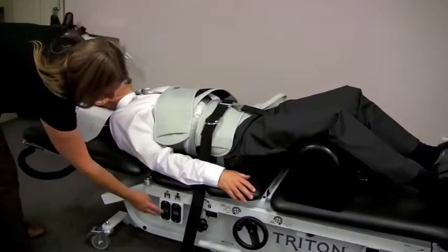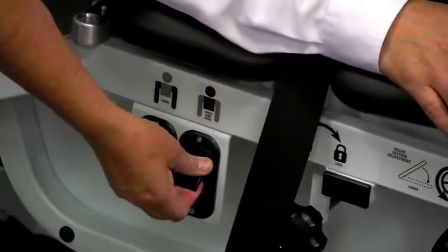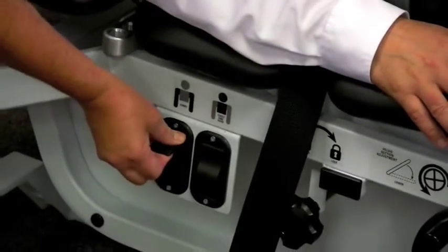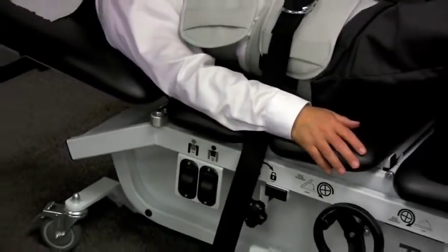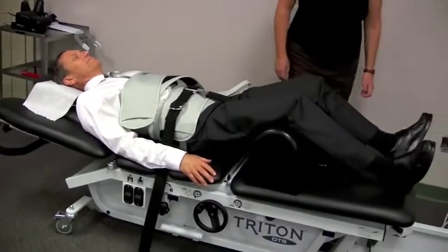I would have to first bring up the cervical piece, and then I'd have to bring up the arm piece. So this is the cervical piece. I just lift this up and bring it up a smidge, and then I can bring this arm piece up a smidge. Okay? Keep it there or put it back down. What do you think? It's fine. You're happy. Okay. So you can really change the different positions with that one.